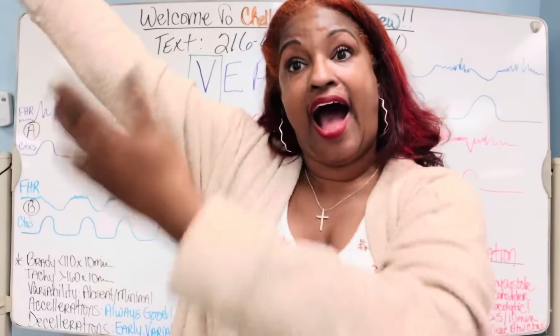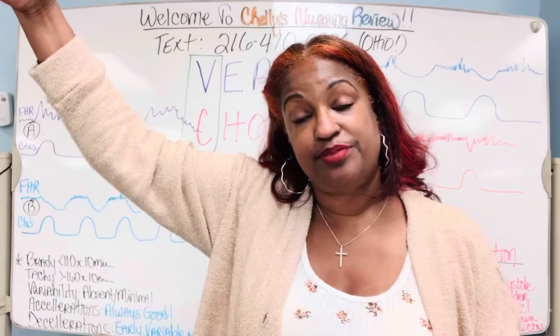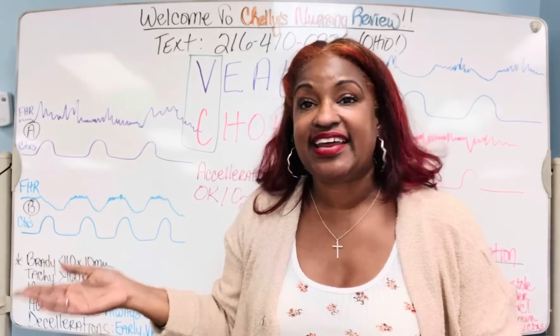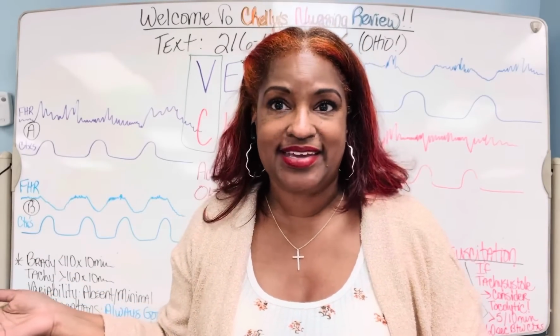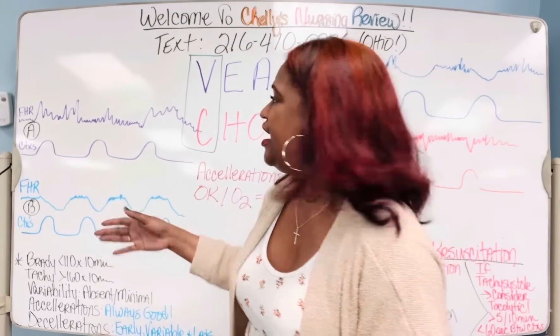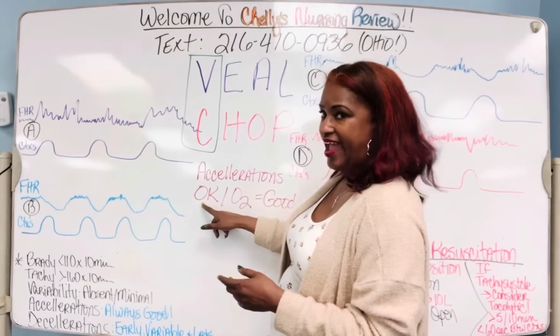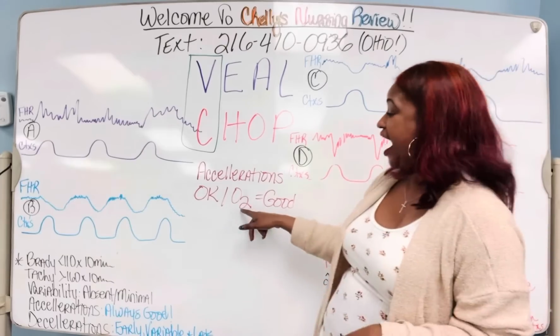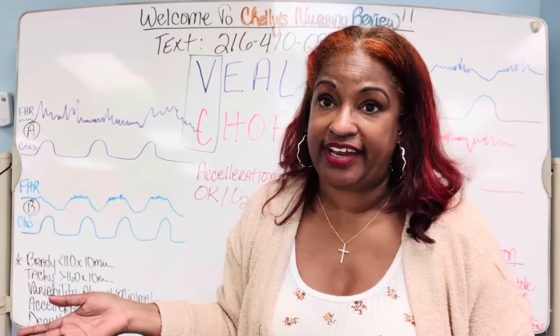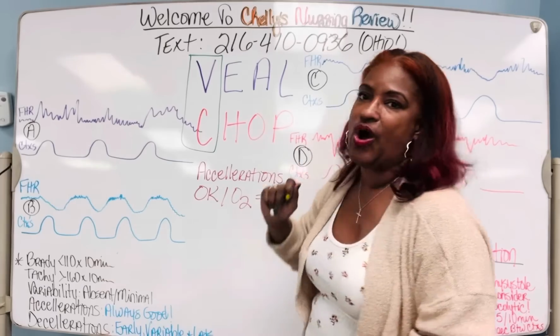The heart rate's going up. Remember what it's going up and how. It's going up 15 beats. It's lasting at least 15 seconds. And it's doing it at least twice in 20 minutes if it's an NST. If it's continuous fetal monitoring because you're in labor, we see these all the time. We know our baby is what? Okay. And oxygen level is good. This baby is very reassuring. So you don't need to do anything with the A and the O.